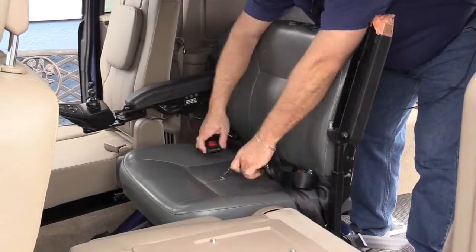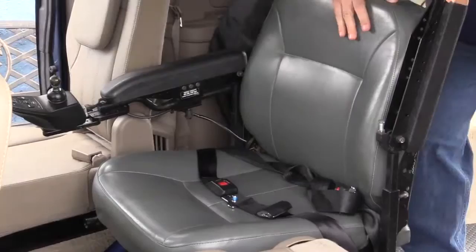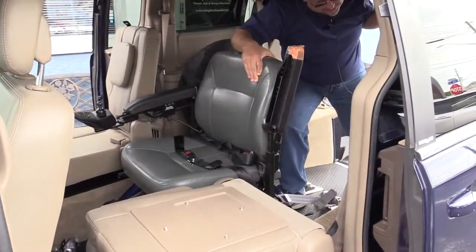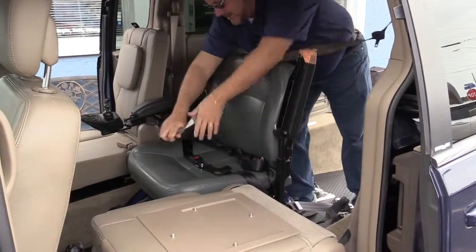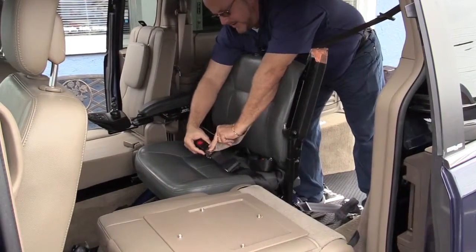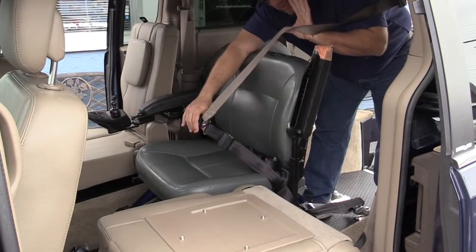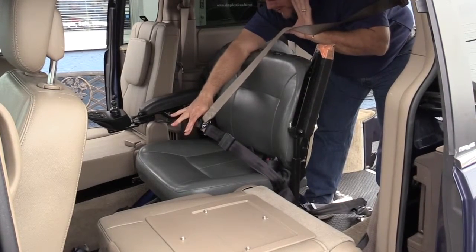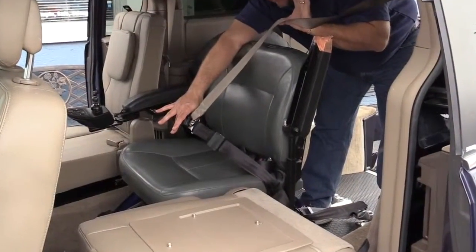Once the lap belt is firmly in place and connected, the integrated retractable shoulder harness — which is a unique feature of Triple S Mobility — can come down and be connected to give the passenger a shoulder harness and a three-point safety belt while seated in the wheelchair.